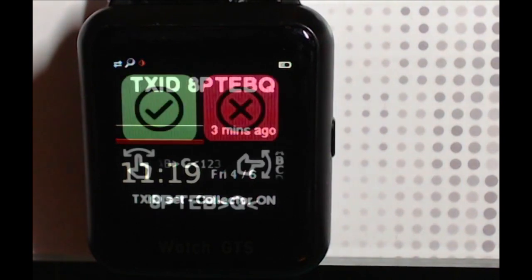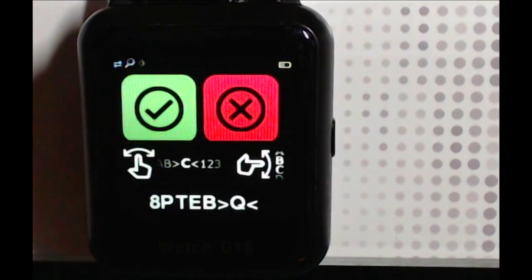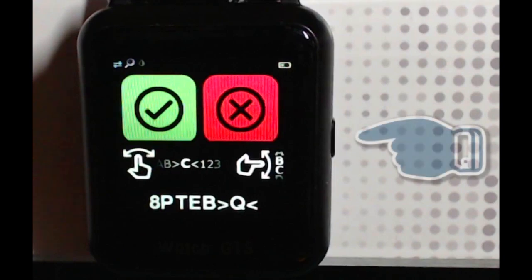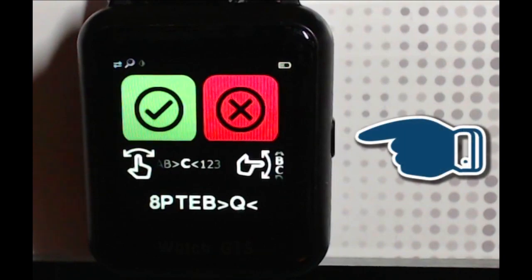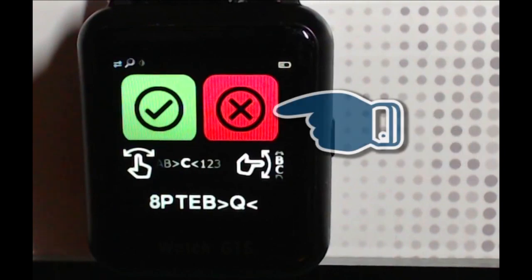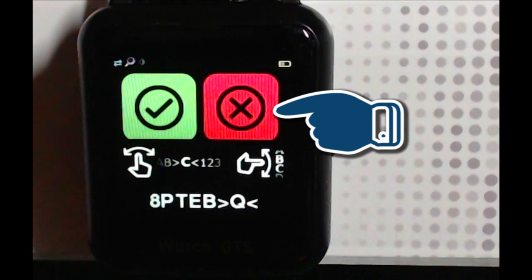Going back to the transmitter ID screen, there are a couple of other things that you can do. If you just want to undo what you've done, just press the button on the side to go back to the main screen. If you want to cancel the transmitter ID and stop the collector, then long press on the red X.